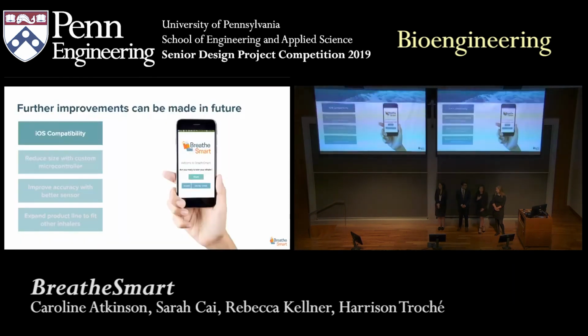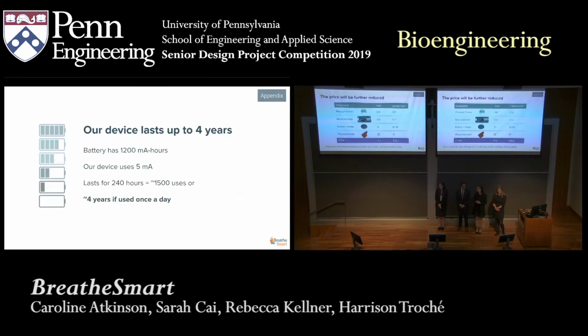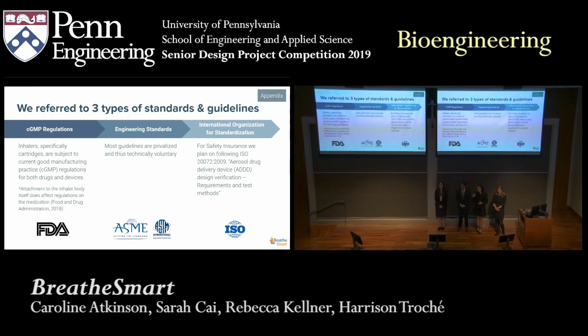Yeah, good question. I can answer that. There are two parts to your question. First, you were asking about FDA approval. We would go through CGMP regulations to ensure that it could be approved by the FDA. We also, in terms of coming up with our objectives, looked at ISO standards specifically for inhalers. And then remind me of the other one.